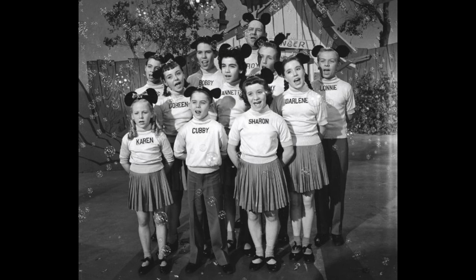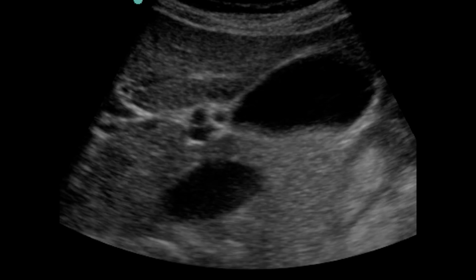So, Mickey Mouse Club, kind of before my time, but why I'm showing you this is because you've heard of the Mickey Mouse sign. Notice the gallbladder in the upper right portion feeds into that confluence here. So here's your portal vein. Make it blue for venous. Mickey Mouse's left ear, if stage left, looking at you, is going to be your hepatic artery. And then there's your common bile duct on the right.